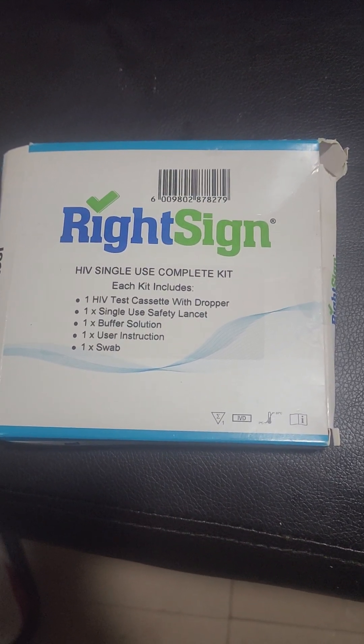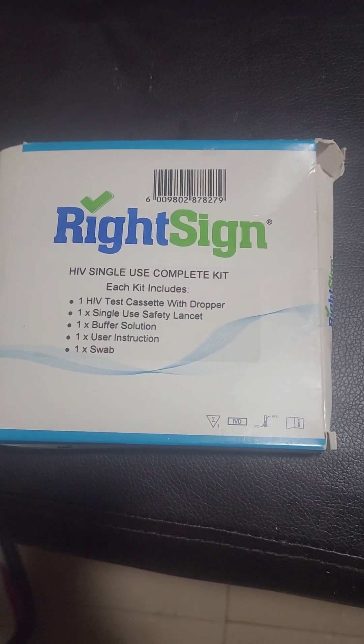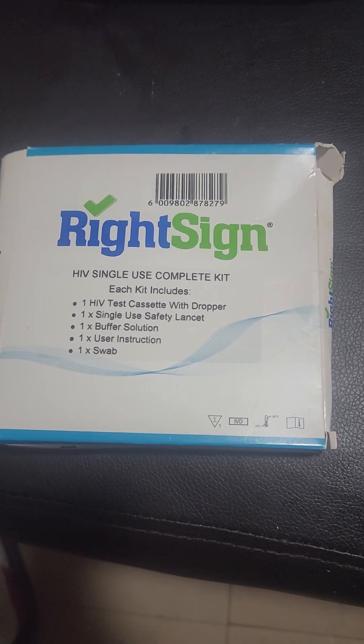Ladies and gentlemen, this is the RightSign HIV Single-Use Test Kit.